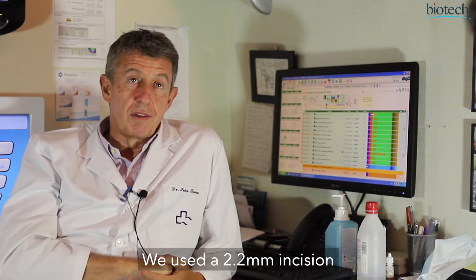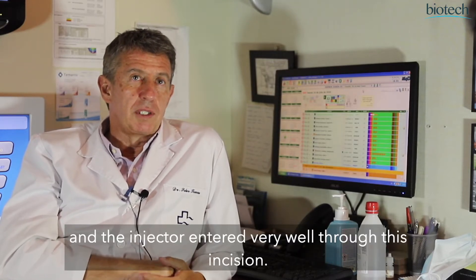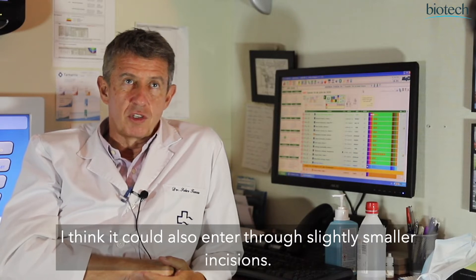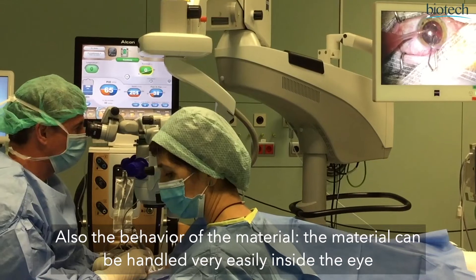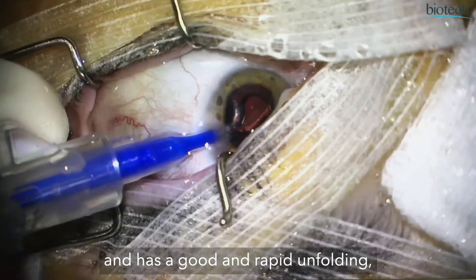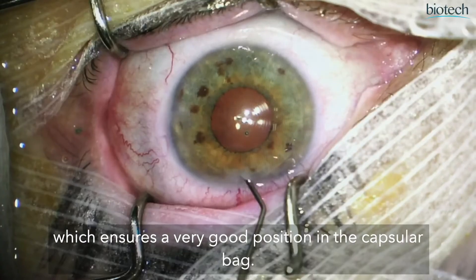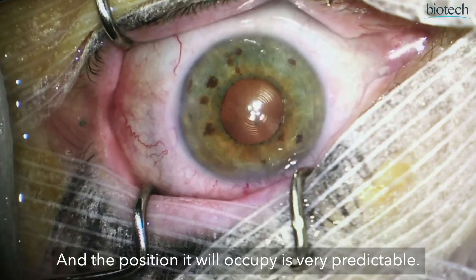With these lenses we use a 2.2mm incision and the injector enters very well for this incision. I think it can also be entered through incisions a little smaller, with good behavior in the material. The material manipulates very well in the eye, has a good and quick deployment, which ensures a very good position in the capsular bag — you can be very sure of the position it occupies.